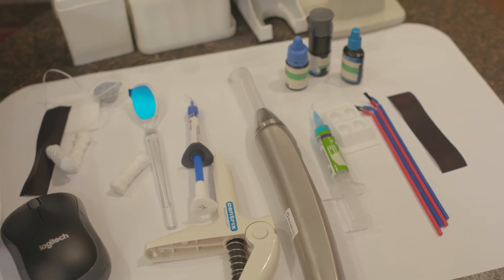During your SMART removal procedure, there are five things that we utilize here at the Art of Dentistry to make certain that you're as protected as we can possibly make you during your mercury amalgam removal.